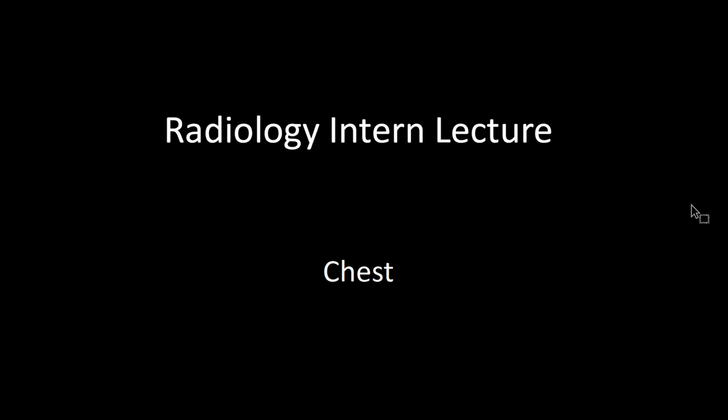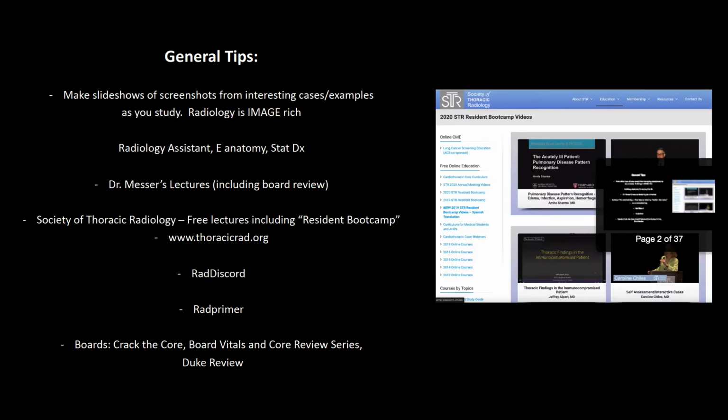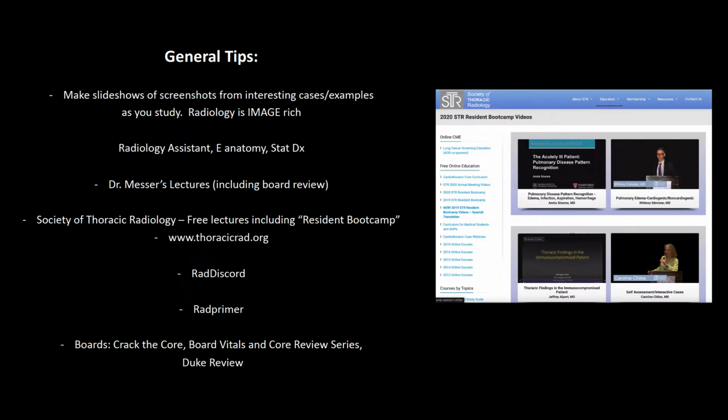Basically, I'm just going to go through some information here that I made a PowerPoint presentation on. I was having a little trouble trying to get the PowerPoint synced with audio correctly, so I just did it through the Adobe app, and hopefully this will come out clearly for you guys. But basically, there's some general tips I wanted to give you over chest radiology.